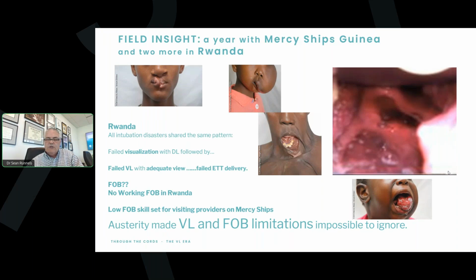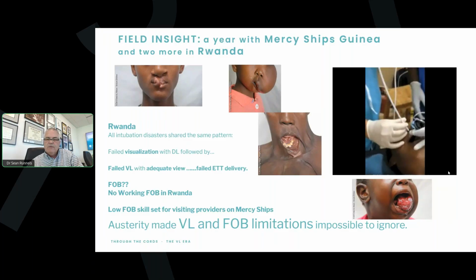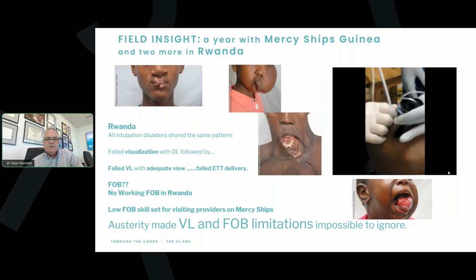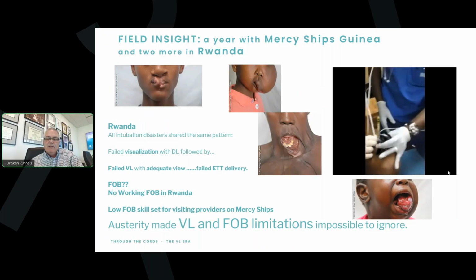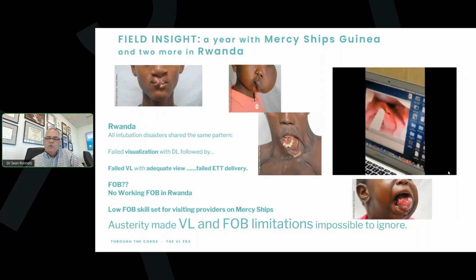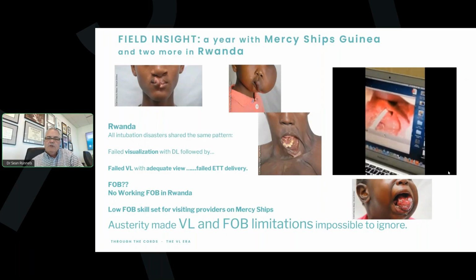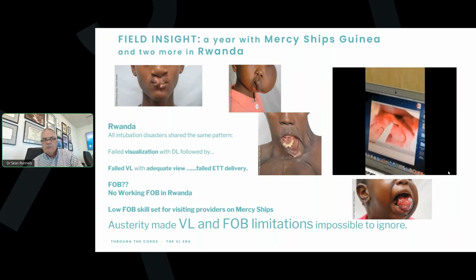Tracheal access was the issue. We did have ambuscopes that a donor had given us. However, they did not donate the screen, God bless their soul. And so we used the ambuscope simply as dynamic introducers. And what I quickly found was I could have somebody see one, I could teach them, they could do one with me, and then they were off to the races and were able to manage these very complex airways really very safely and quickly. It was a very efficient way to intubate.